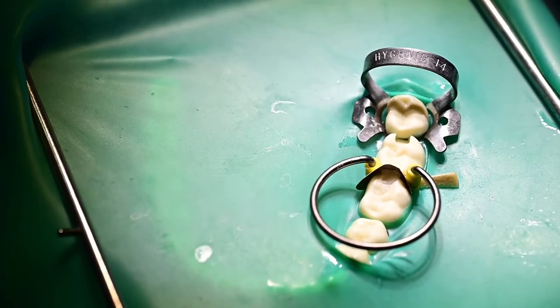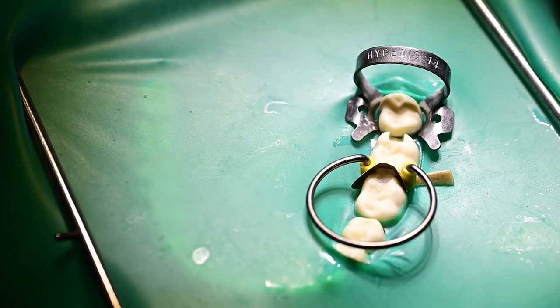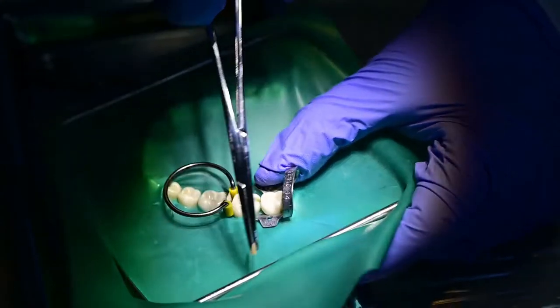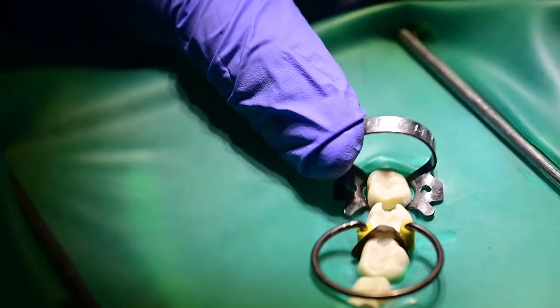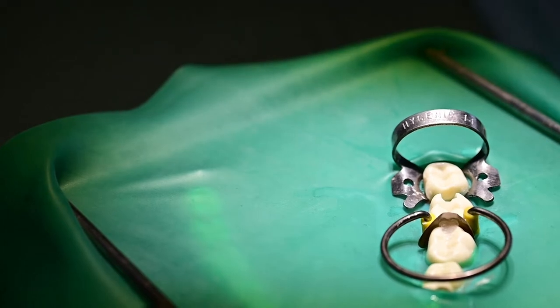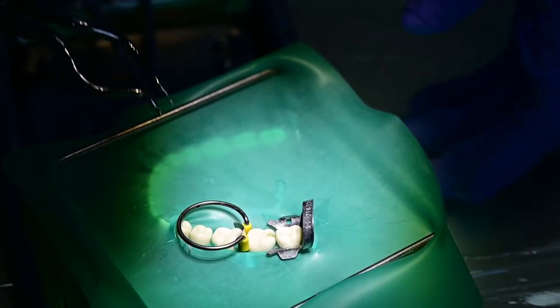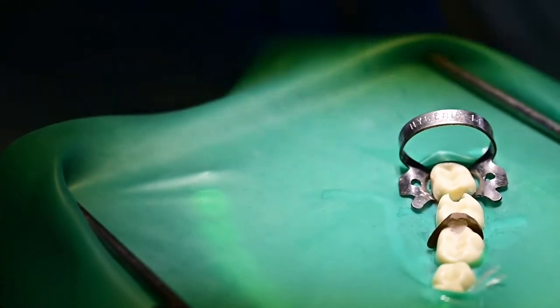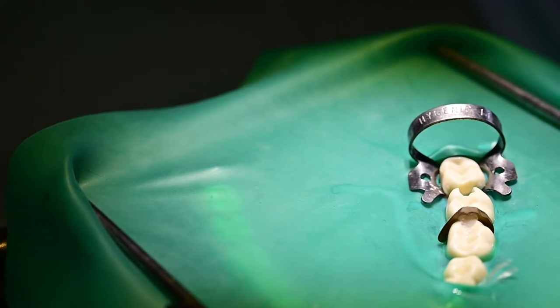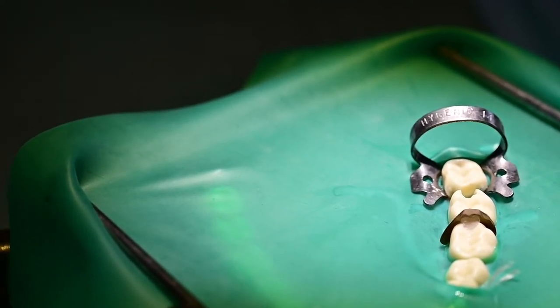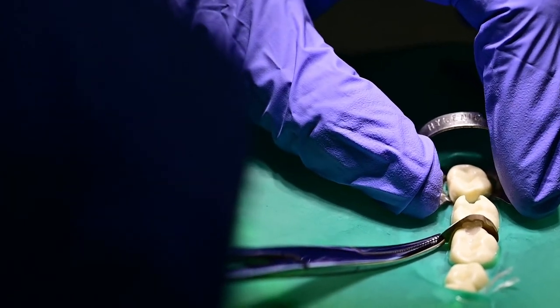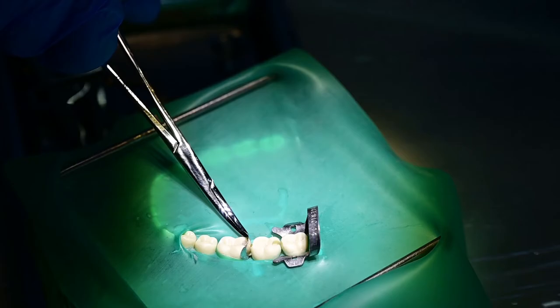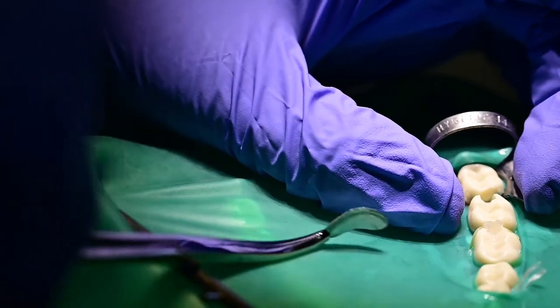Now I am ready to remove the ring. But I can even commence with the wedge. So I want to disassemble the assembly. I first remove the wedge with my curved mosquito artery forceps. And then I proceed to now remove the ring. And then I will be retrieving the band. And it should be pretty difficult to disengage the band. Which gives you an idea of how a tight proximal contact you have achieved. So it should not just be easy. And there I go.